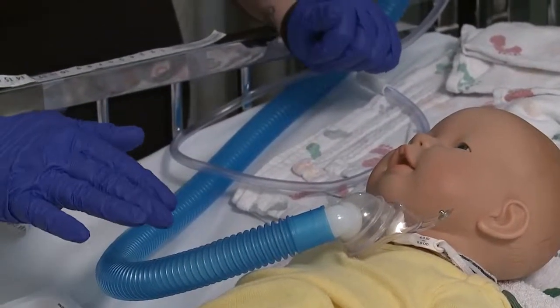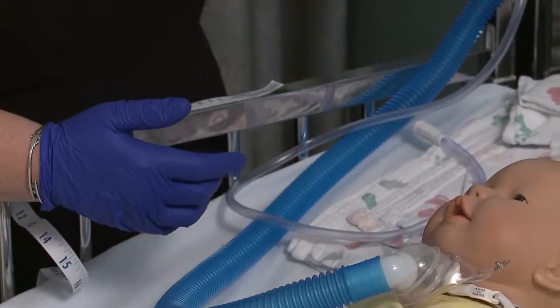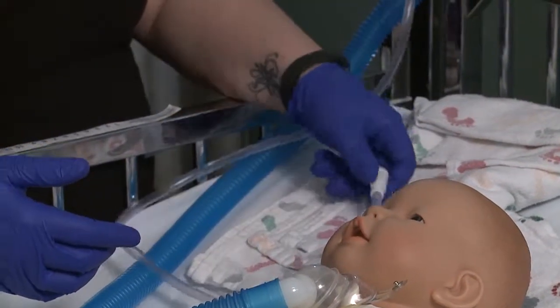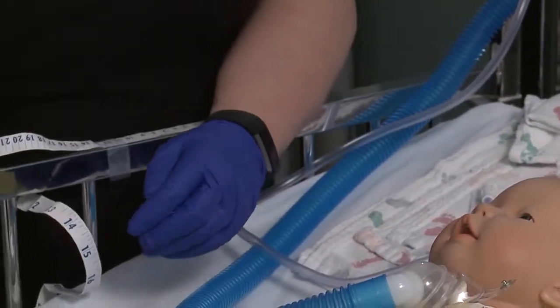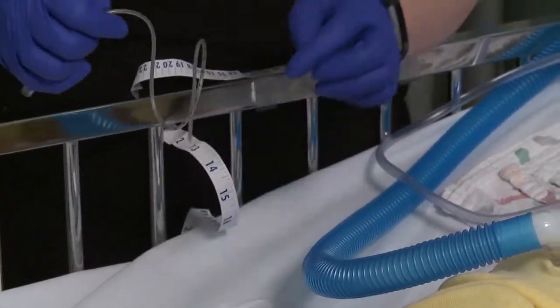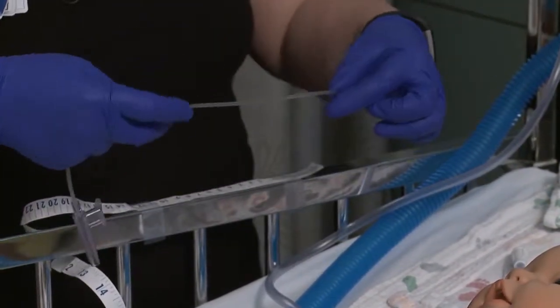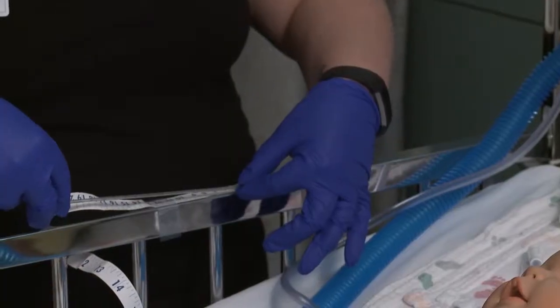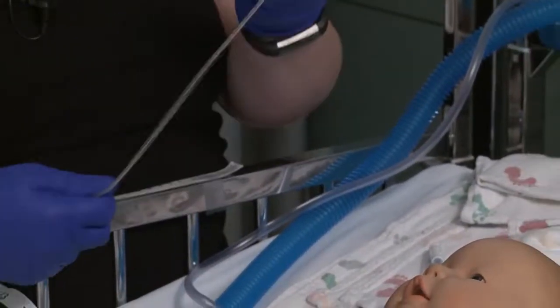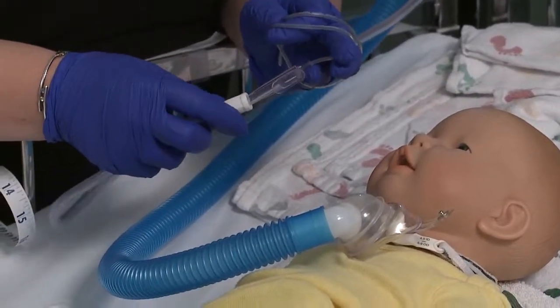Safe suctioning your baby. I have washed my hands, turned my suction equipment on, tested that it is working appropriately, and put on my gloves. Pulling your suction catheter out of its kit, you try to maintain it clean while at the same time measuring where your safe suctioning depth is, not touching the tip to anything. Attaching your suction to the suction catheter.